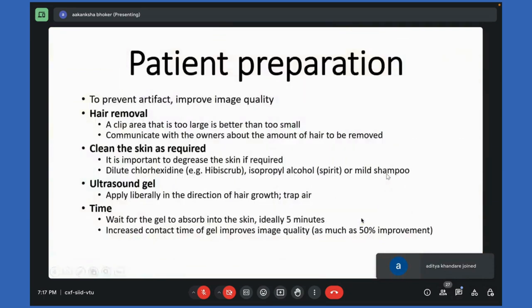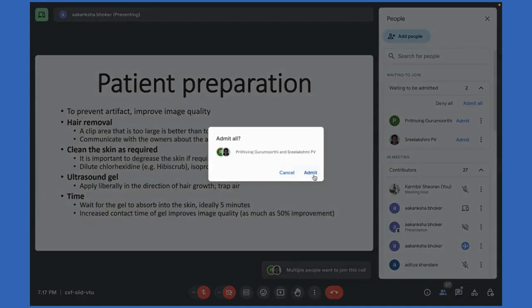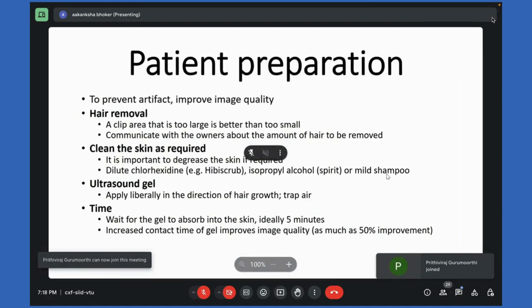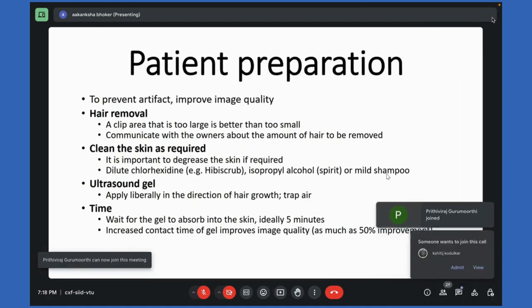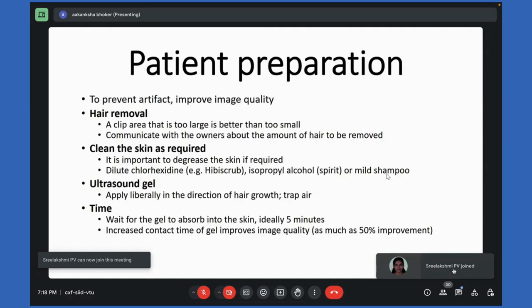So, the first and most important aspect while performing any sonographic examination is the patient preparation. We need to prepare our patient in advance so that there can be best visualization of each and every organ. For that, the first and most essential step is hair clipping. A large area is to be made free of hair so that there are no small air bubbles trapped in between the hair, because we already know that air is a barrier to ultrasound waves.